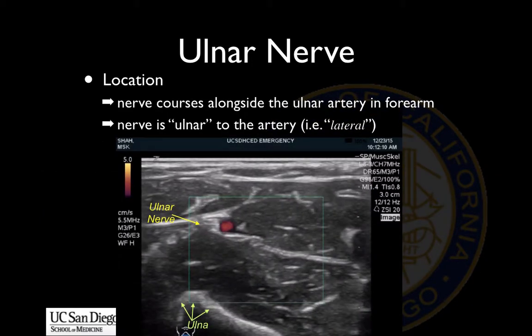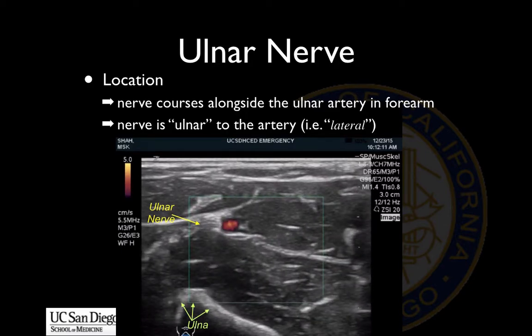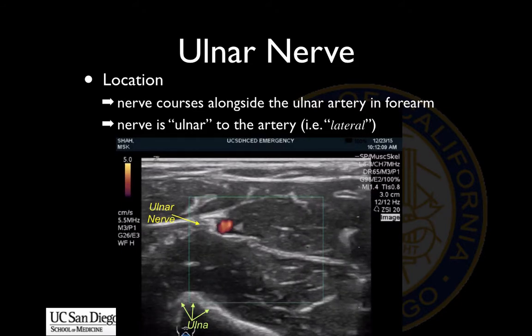And once more, here is the same patient being scanned in Doppler mode. Notice again that the ulnar artery demonstrates flow and the ulnar nerve neighbors the vessel.